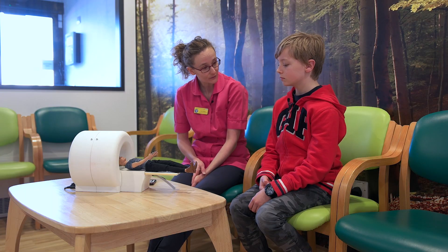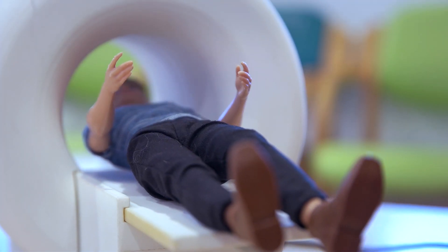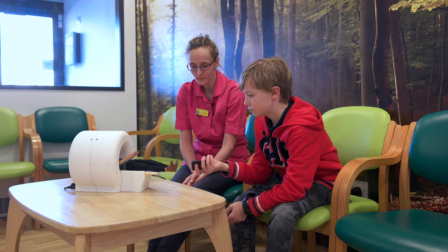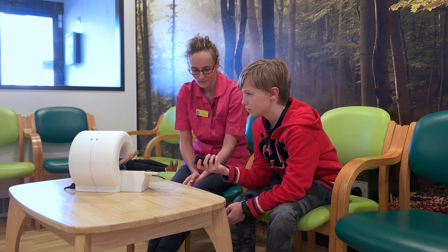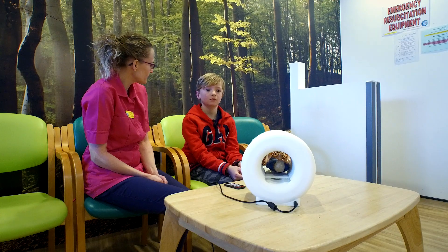Shall we have a listen to some of the sounds? Press the enter button down here — you can make the bed go into the scanner and start the noises. What do you think of that? That was noisy. That was very, very noisy, wasn't it?